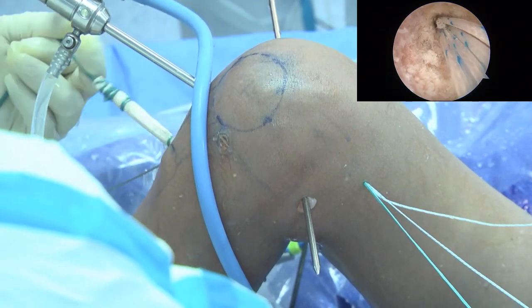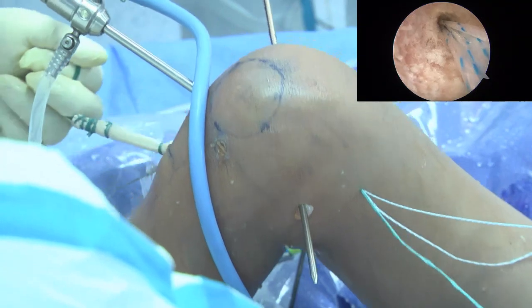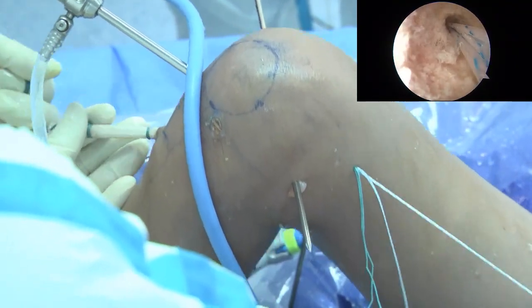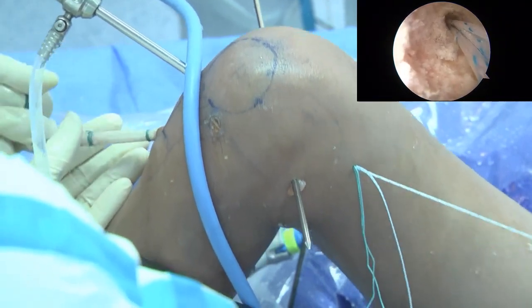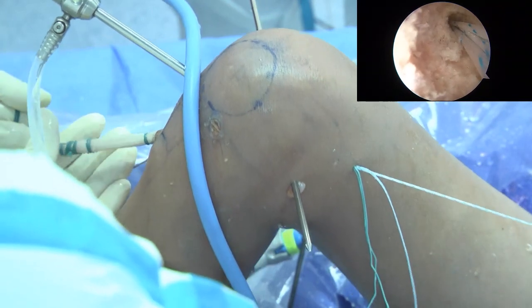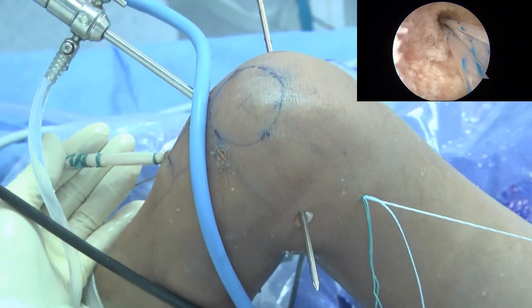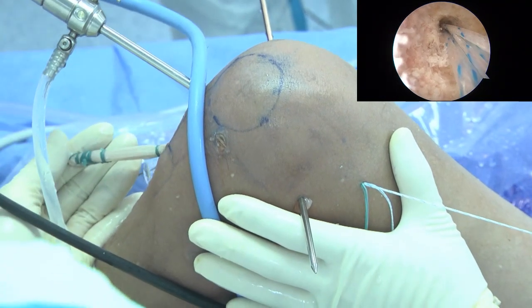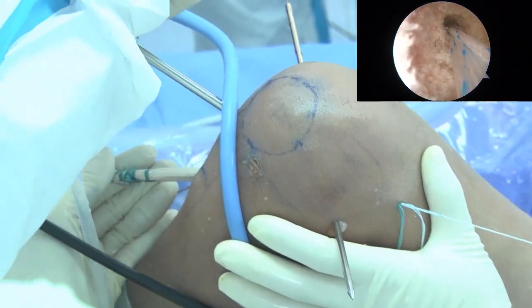Make sure that it's strong. You pull the graft down. Okay, here. 那这一步呢？要对移植物远端施力。你看一下，板是不会重新进入骨隧道的。Okay, 对对对。Yeah, it's not getting down. Now we pull the graft in. 所以是不能往回走的这个钛板。Here, you see that it starts to slide.